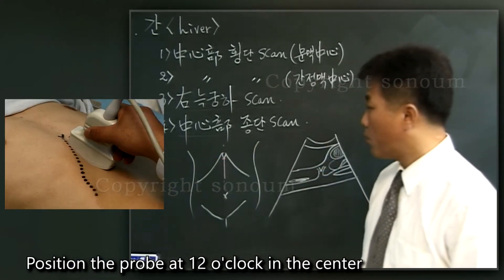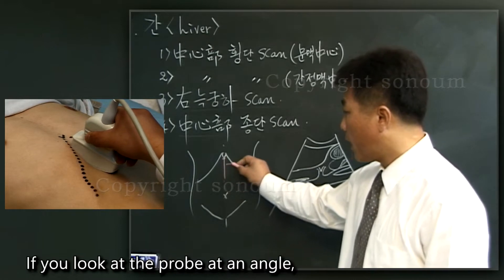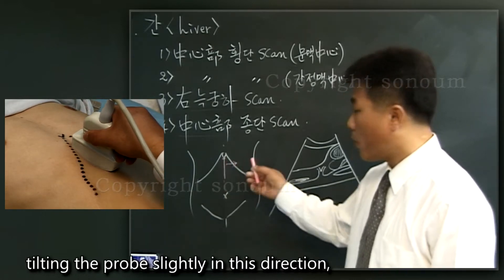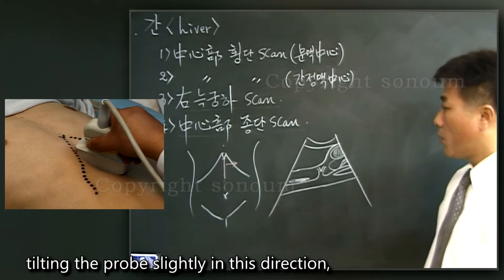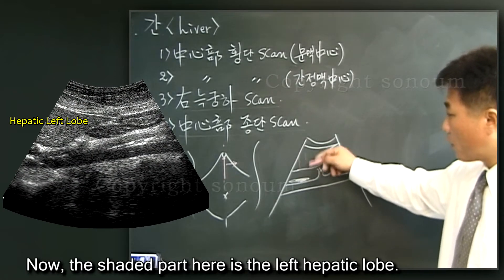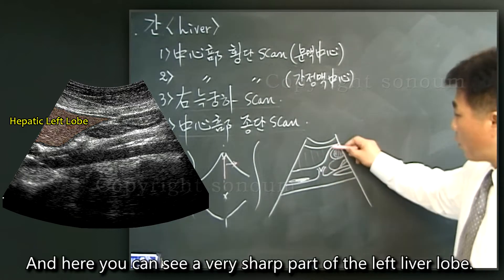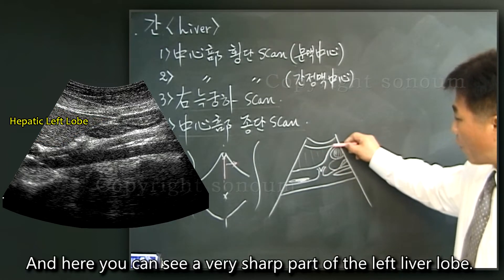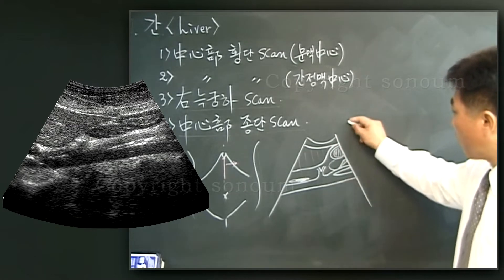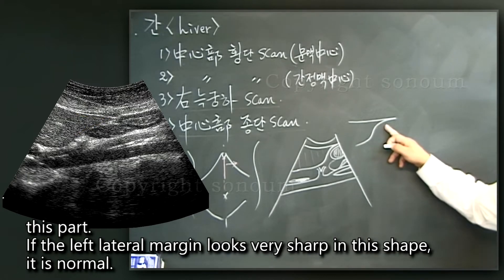Position the probe at 12 o'clock in the center and do not scan right away. If you look at the probe at an angle, tilting the probe slightly in this direction, you will see a picture like this. The shaded part here is the left hepatic lobe, and here you can see a very sharp part of the left liver lobe. If the left lateral margin looks very sharp in this shape, it is normal.